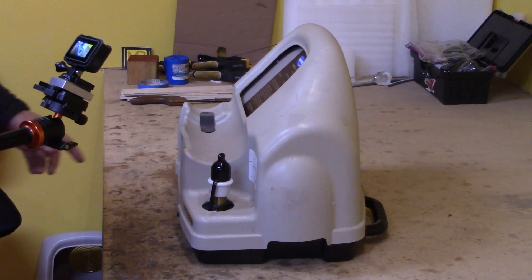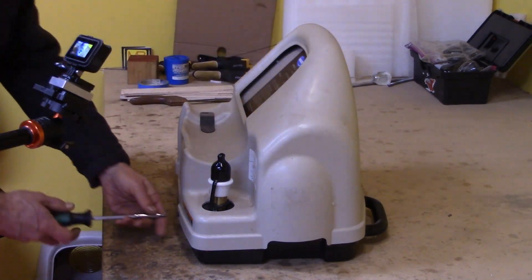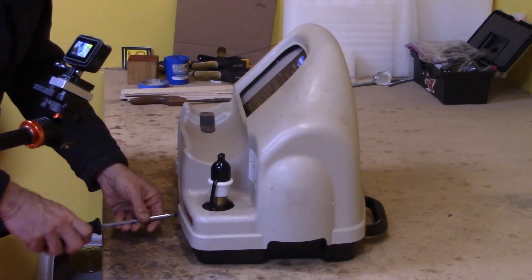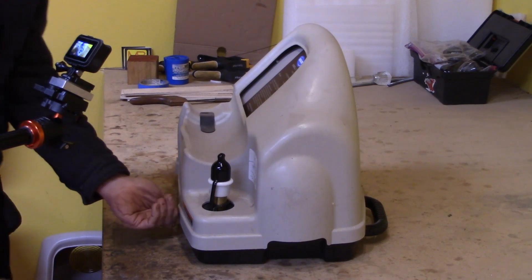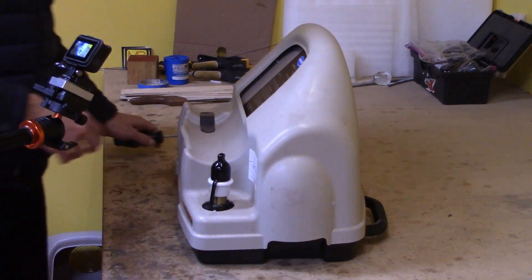First step is there's four screws that hold the top on. I've got three of them out now and really nothing that informative about watching unscrewing. The top comes off really easy with a standard Phillips screwdriver.